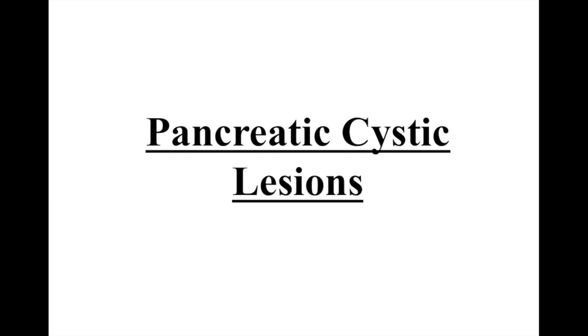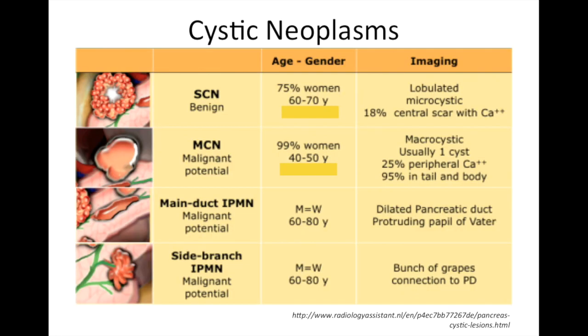Alright, welcome back for the second video on pancreatic cystic lesions. We're going to start with cystic neoplasms. This is a nice review table from a radiology website. And as we start talking about cysts, I'm going to throw out some buzzwords to remind you which lesions we're concerned about and which lesions we're less concerned about.